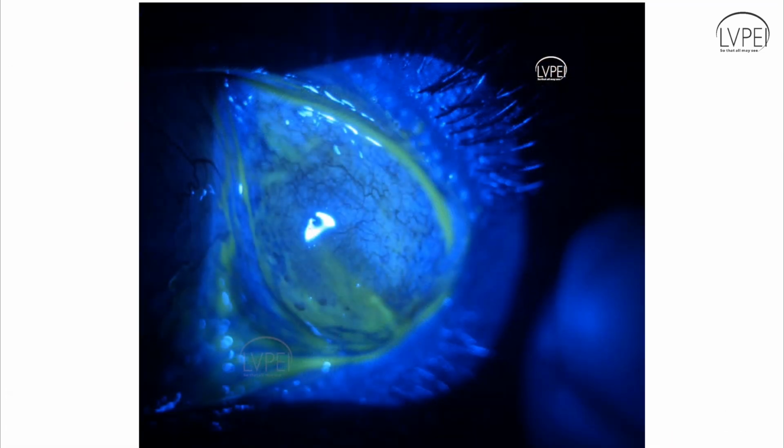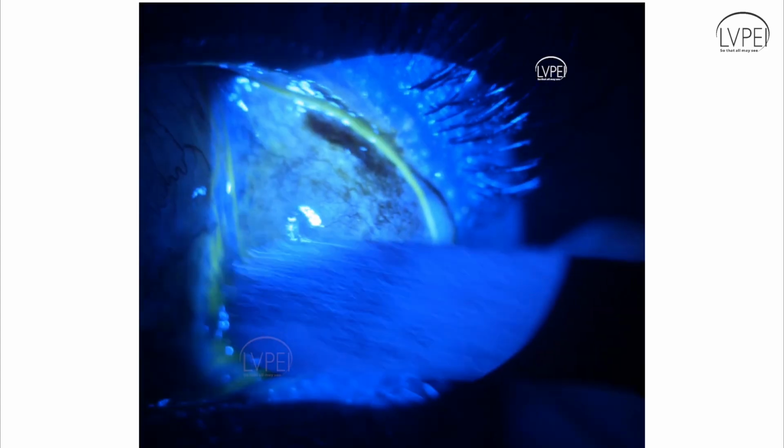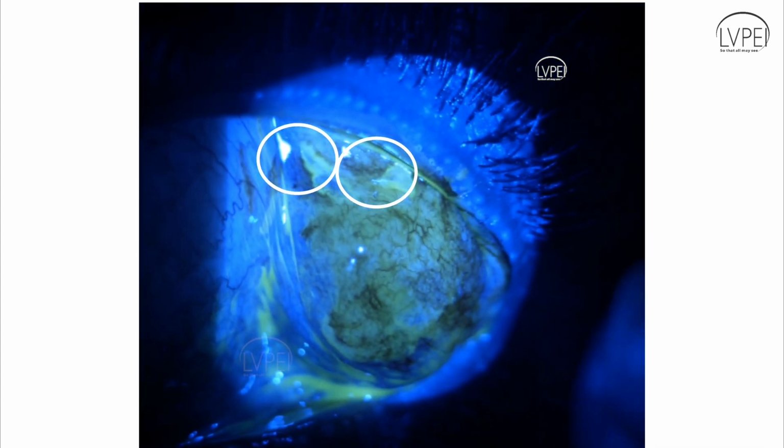A simple preoperative fluorescein staining and DATS in Dacryops can serve as a great guidance to avoid damage to lacrimal gland ductules during surgical excision.